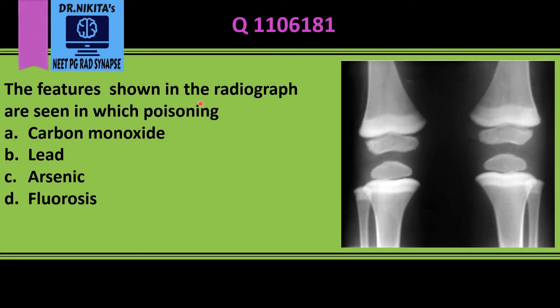The features shown in the radiograph are seen in which poisoning? This is a radiograph of the knee where we see dense white metaphyseal bands in the femur, tibia, and fibula bilaterally.